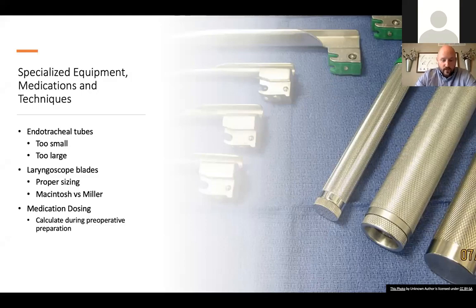One which is too small may result in the inability to effectively occlude the airway, resulting in ineffective ventilatory control, or one which is too large may increase pressure placed on the tracheal mucosa, resulting in tracheal edema and an increased risk of post-op extubation airway occlusion.